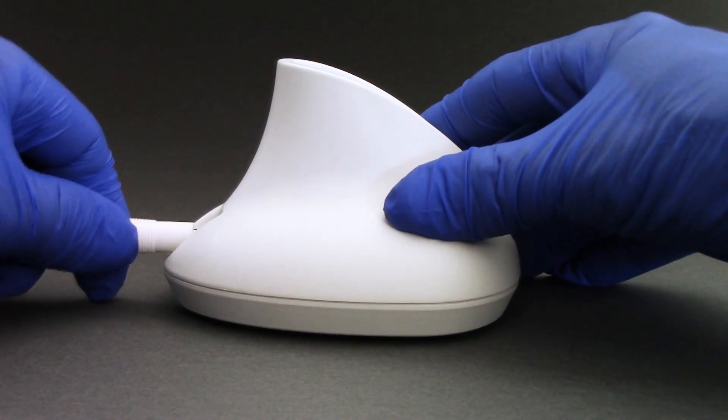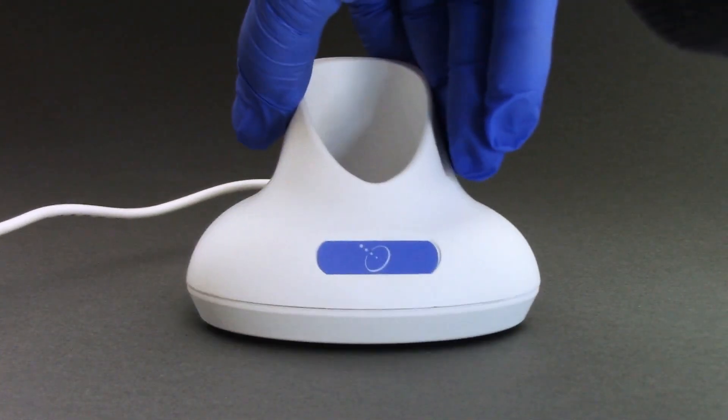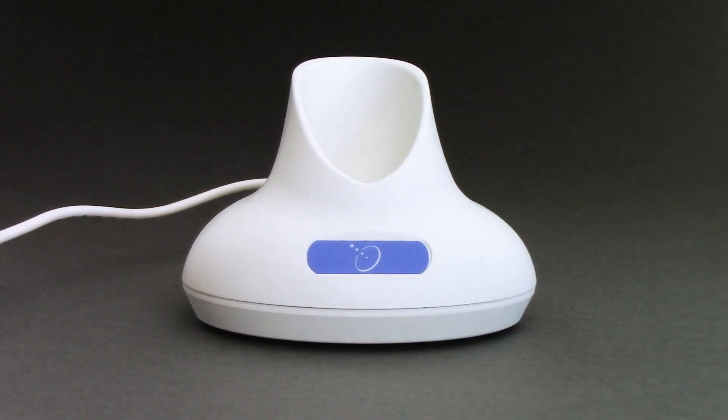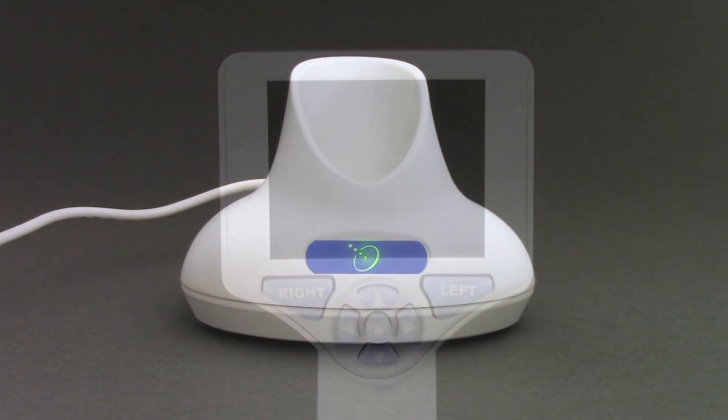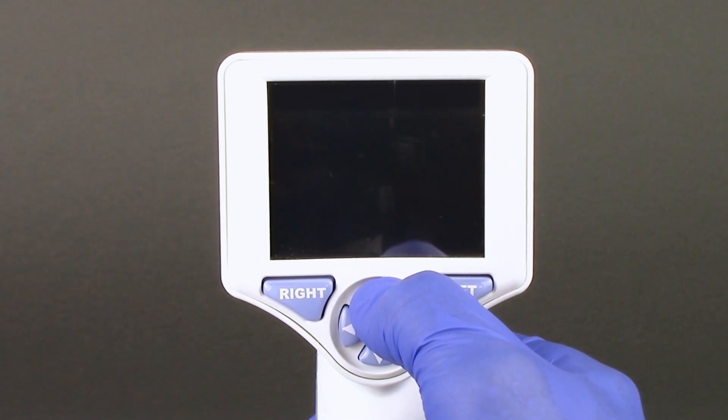Connect the power supply to the NPI 200 charging station, then plug into a power outlet. The green light illuminated at the base of the NPI 200 charging station indicates power is established. To turn on the NPI 200, press and hold the up button on the device.